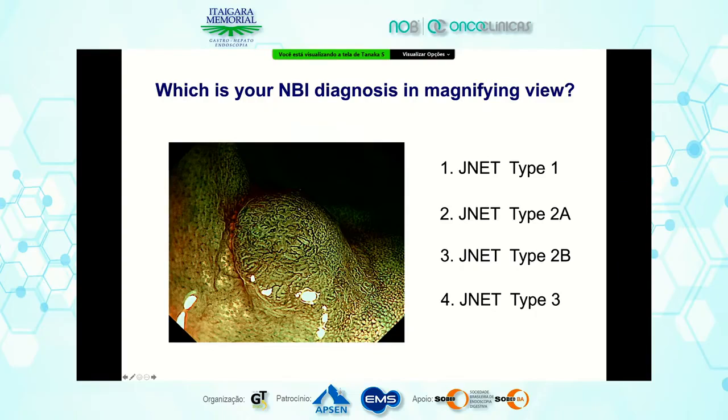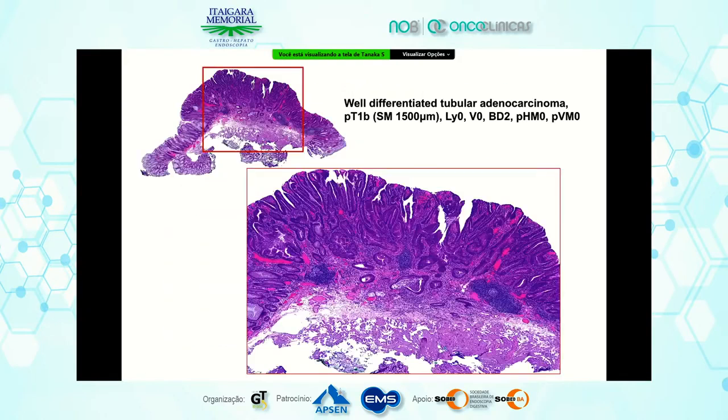There is an irregular pit-like structure. Overdiagnosis is dangerous because overtreatment with surgery will be conducted. Anyway, this is a very tiny lesion. We conducted EMR. This is also SM invasive carcinoma. For JNet type 2B and JNet type 3, please pay attention to treatment selection.